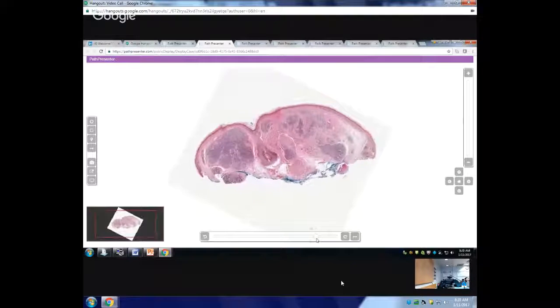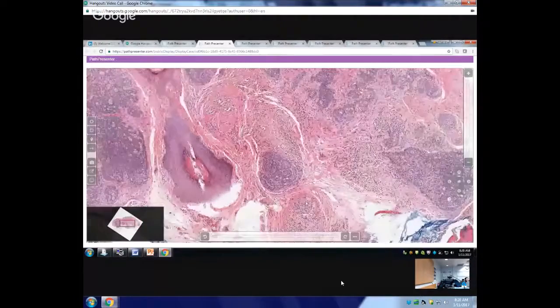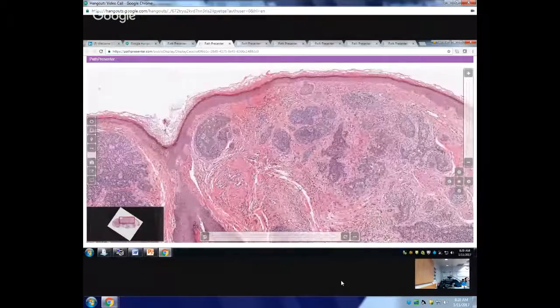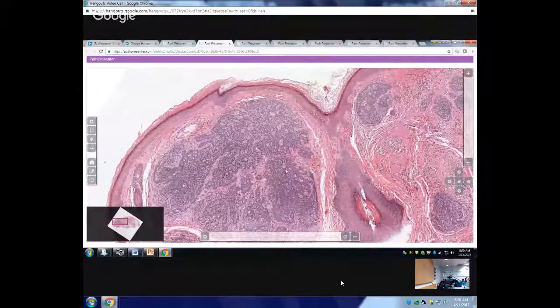This looks different. Yeah, so again you have a basaloid neoplasm actually. But now it doesn't have that infiltrating pattern. What do you see here actually? Some islands, like basaloid cell islands. Basaloid cell islands. So again that same thought process should go in your mind.